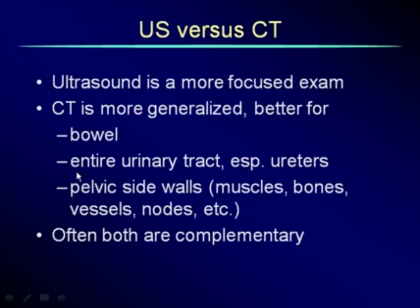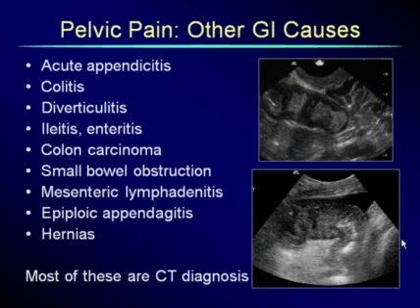It's much better for evaluation of bowel. We see the entire urinary tract, especially the ureters, which we can't really see with ultrasound. We can see pelvic sidewall structures, muscles, bones, vessels, nodes, etc. And when we deal with complicated pelvic situations, often both examinations are complementary.